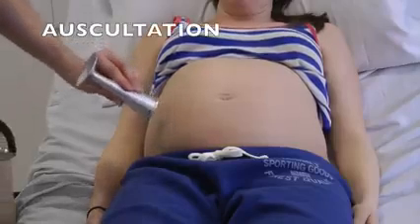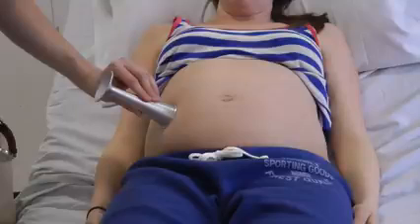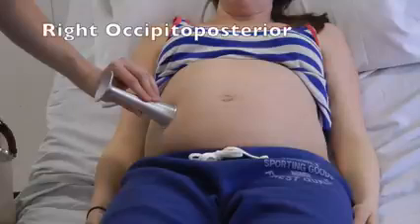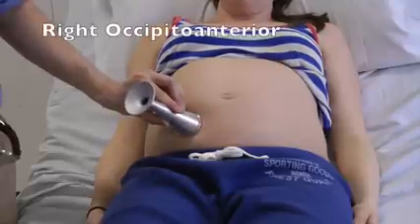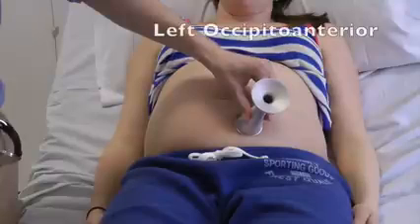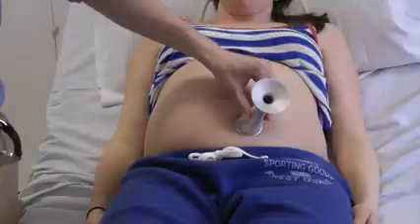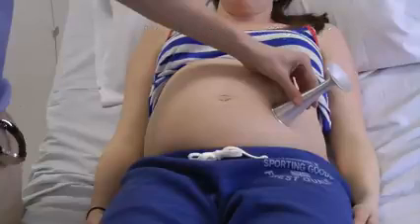Finally, auscultation. Place the Pinard stethoscope over the anterior shoulder. This will depend on your clinical judgment of fetal position. Place it here for the right occipito-posterior position. Here for the right occipito-anterior position. Here for the left occipito-anterior position. And here for the left occipito-posterior position.